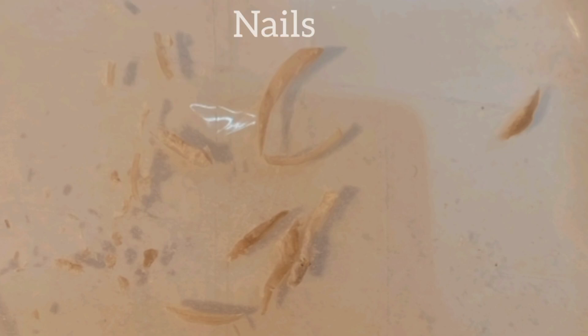In the laboratory, the diagnosis of a fungal nail infection, onychomycosis, follows a precise multi-step protocol. 1. Reception and preparation. The sample, consisting of nail clippings from the patient, is first received at the laboratory.